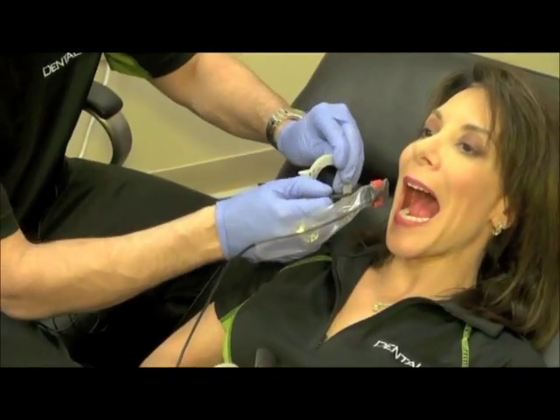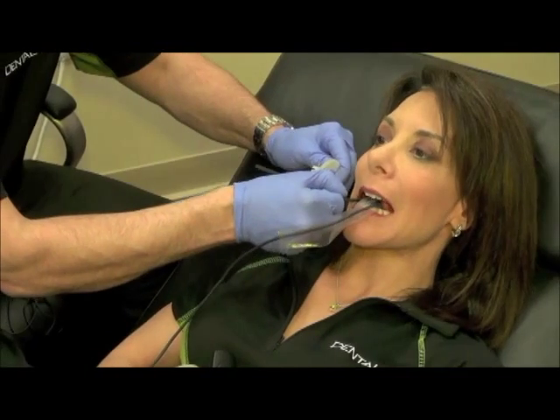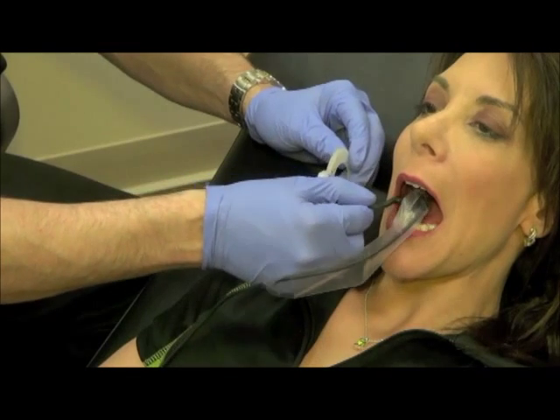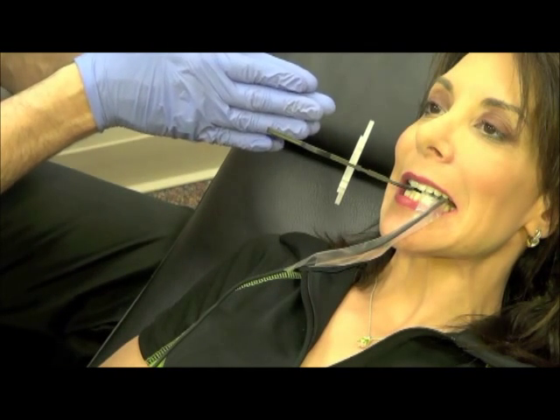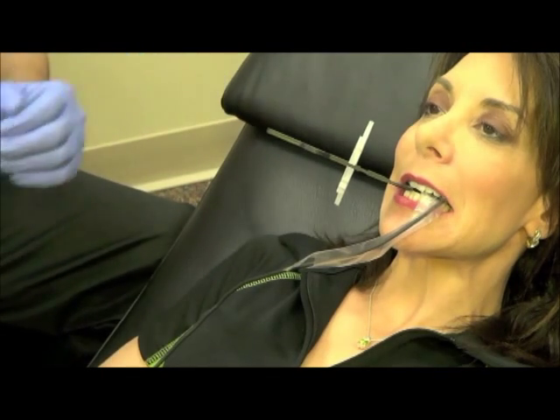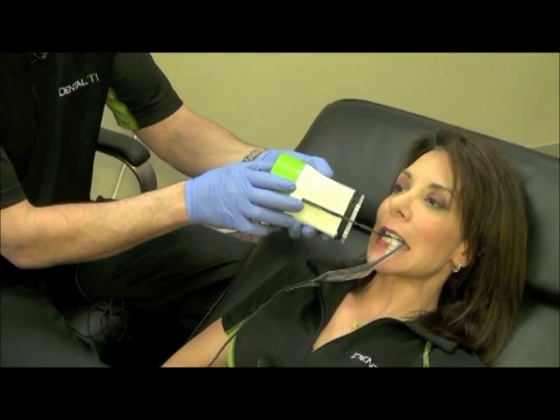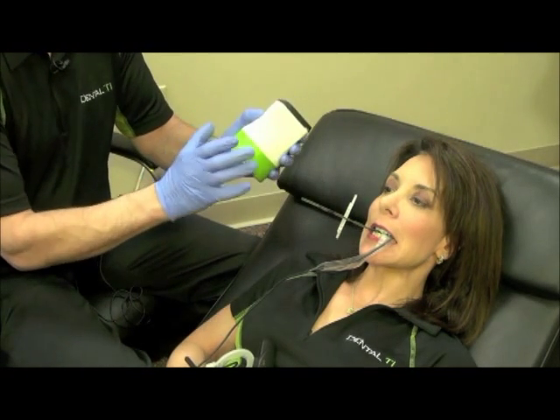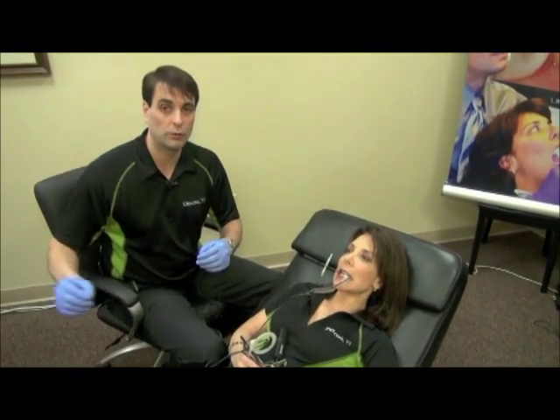Placement with the red holder is the same as with the yellow. The grid is here for alignment — you want that to first bisect the posterior mandibular contact and take that x-ray, then shift the sensor to the other side of the mouth, with the lines bisecting the canine to premolar contact, and then take that x-ray. Incidentally, if you're not lowering the exposure when you're coming forward to take a premolar bite wing, pull the tube head back about a half of an inch, and that will help you avoid getting premolar or cervical burnout in the premolar region.